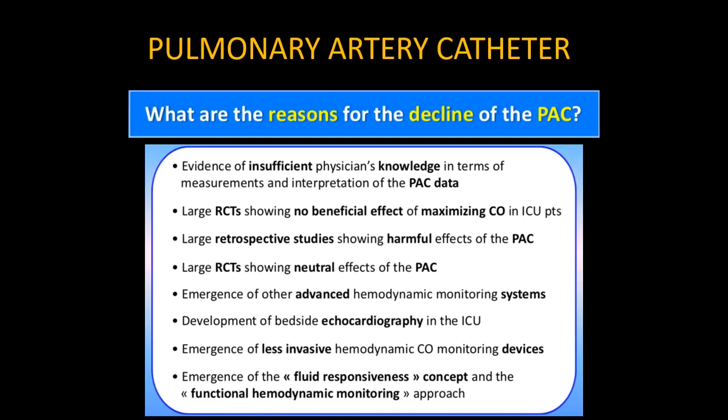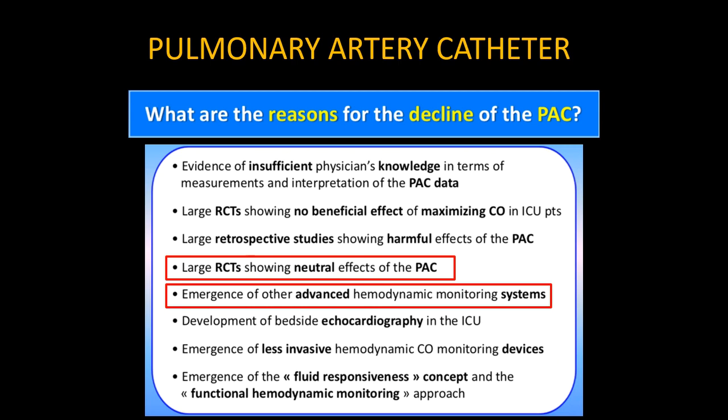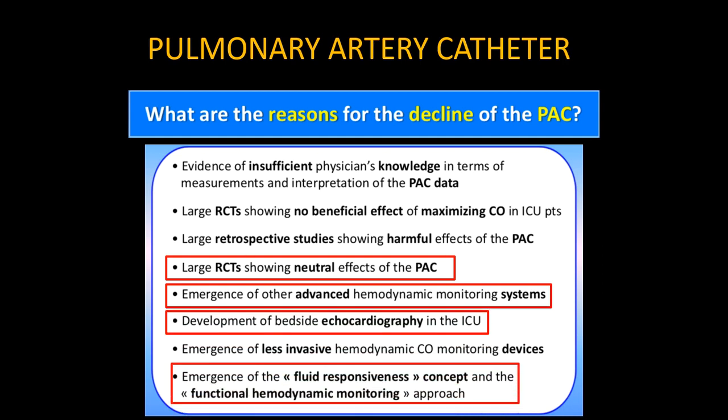So what are the reasons for the decline of the PAC? The main reasons are large RCTs showing a neutral effect of the PAC, the emergence of other advanced hemodynamic monitoring systems like pulse contour analysis, the development of bedside echocardiography in the ICU, and the emergence of the fluid responsive concept and the functional hemodynamic monitoring approach.